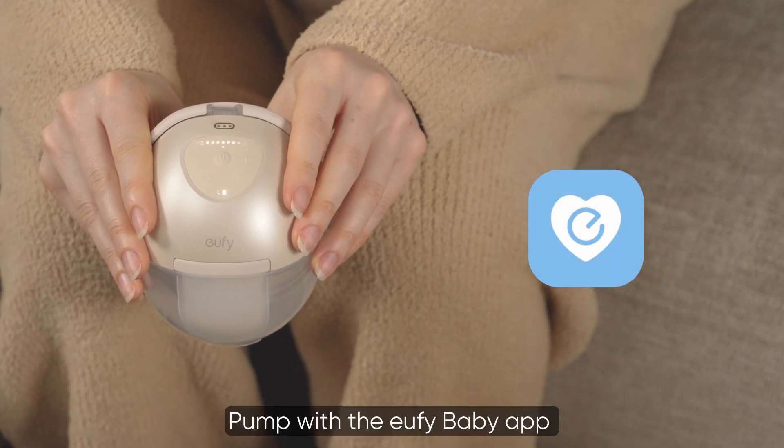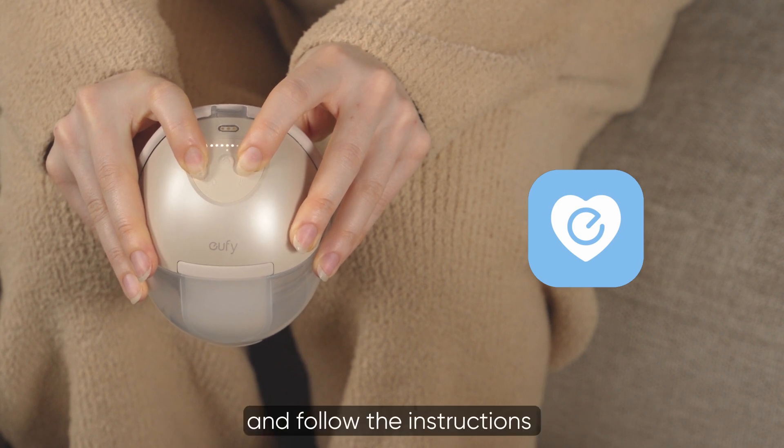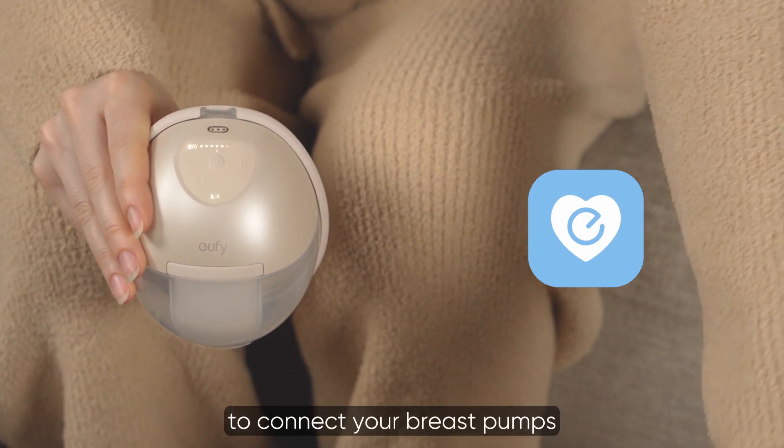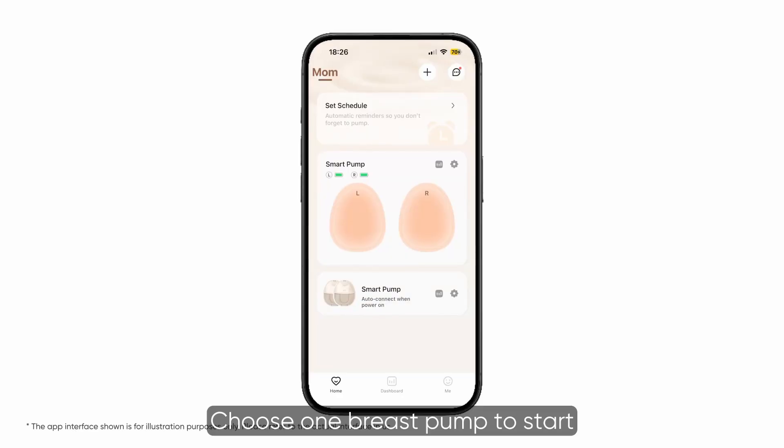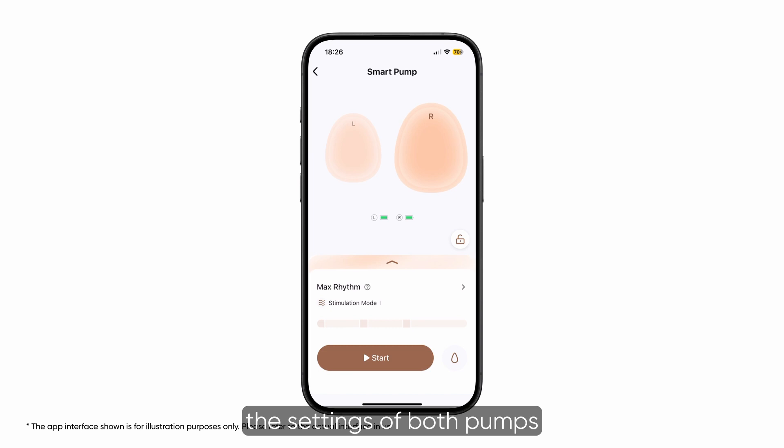Pump with the Eufy Baby app to remotely control your session. Log in or sign up and follow the instructions to connect your breast pumps. Choose one breast pump to start, or tap the sync button to synchronize the settings of both pumps.